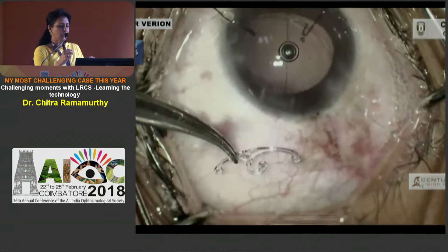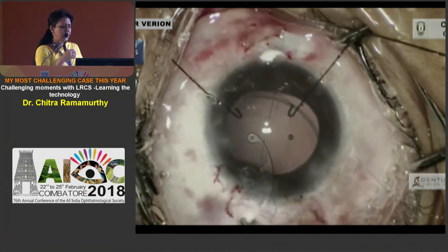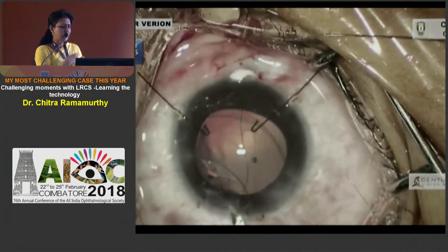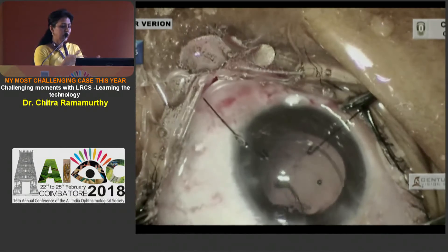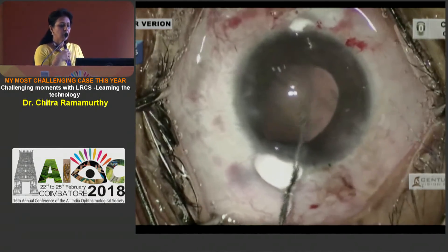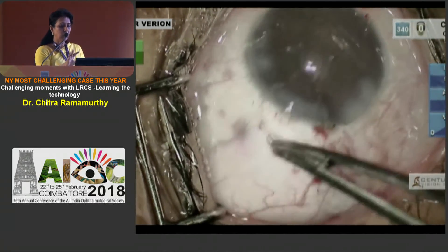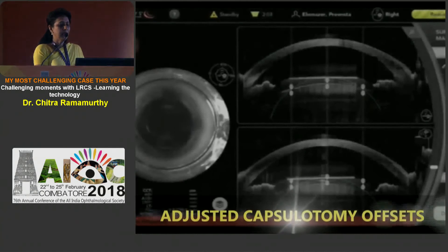I pass the suture and then pass the other end of the suture through the islet of the Ahmed segment, then push in the Ahmed segment — and this is where I have a challenge. I managed to push it in, but it keeps coming back to the incision site rather than floating back to occupy its space in the capsule fornices. I realized I had probably passed the suture through the layers of the corneal lamellae, so I try to open it up, and then I realize I've actually cut the suture. I bring out the Ahmed segment, and by the time it hits the capsule, I have a PCR. I realize I have to call the end of the game, remove the CTR, go back in and do a gentle anterior vitrectomy, then inject pilocarpine and position an iris clip lens, clipping it to the retro portion of the iris — and I bail myself out of this case.